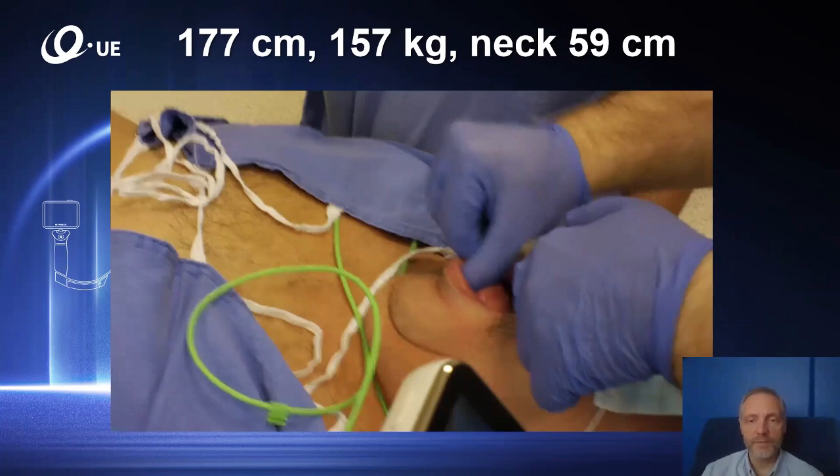As you can see in this movie, the intubation was fast and atraumatic in this patient. The very fast intubation is important also because in those patients, the oxygen reserves are very limited and the intubation must be performed quite fast to prevent desaturation of the patient during the intubation efforts.